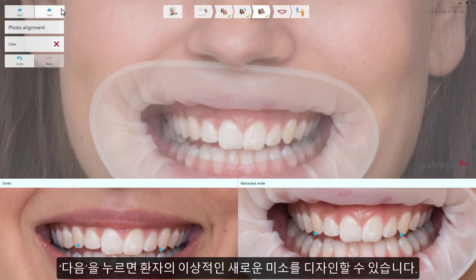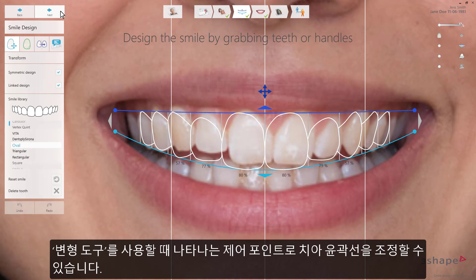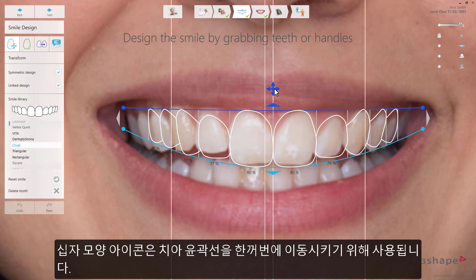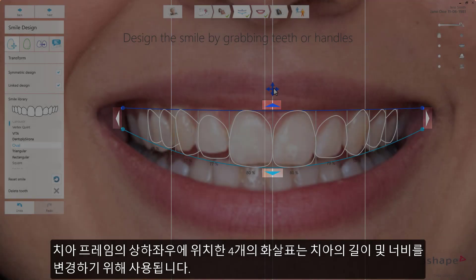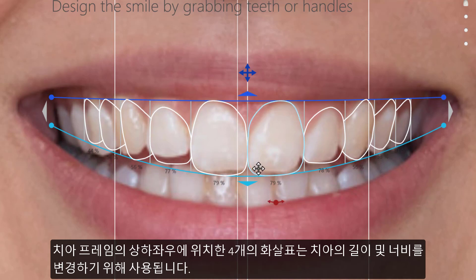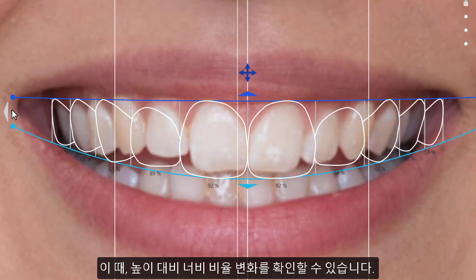Press Next to start designing your patient's new smile. When entering the smile design step, you'll see the patient's photo with a 2D outline of the teeth placed on top. The placement of these smile frame outlines can be adjusted with the Transform tool, using the control points available when pressing the smile frame. The cross symbol can be used to move the smile frame to a different position on the photo. The four arrows located above, below, and to either side of the smile frame can be used to change the length and width of the teeth in the outline. You'll notice a change in the height to width ratio, shown as a percentage below each tooth.